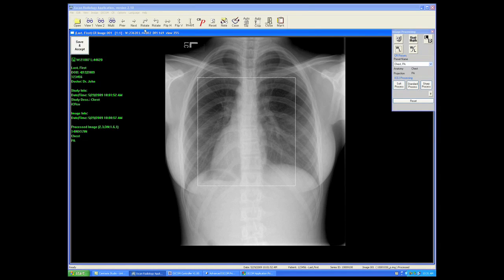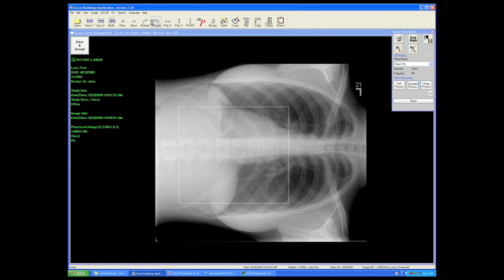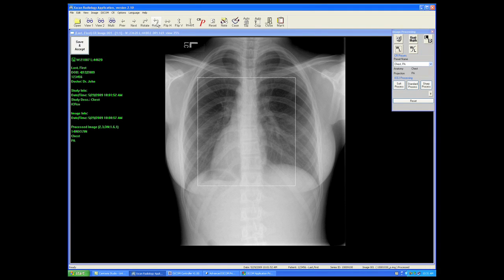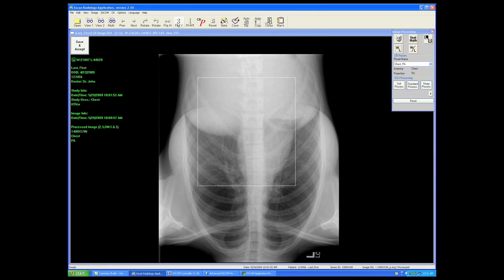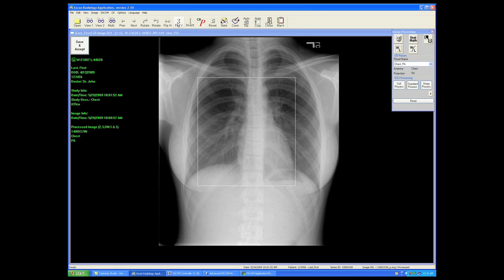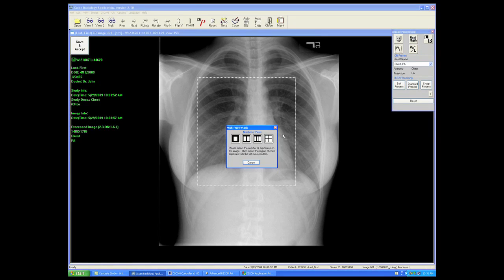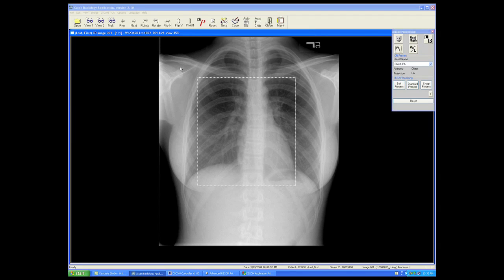Next, we have orienting the image: rotating it to the right, rotating it to the left, flipping it horizontally, flipping it vertically. We also have applying a mask to the image.